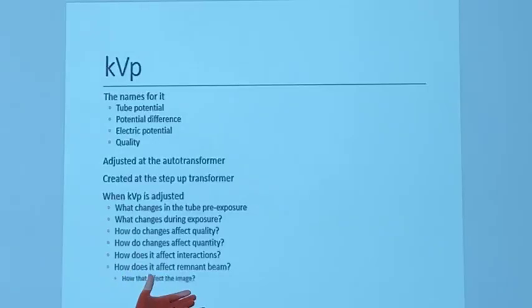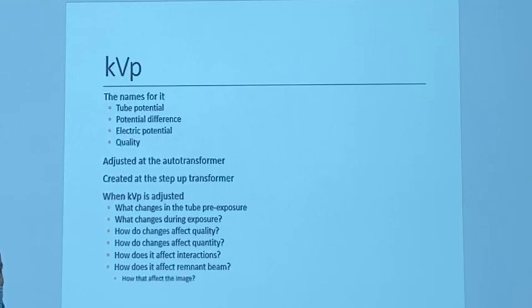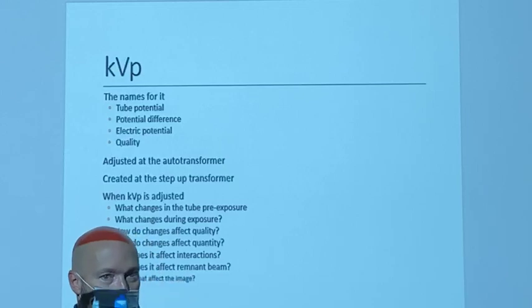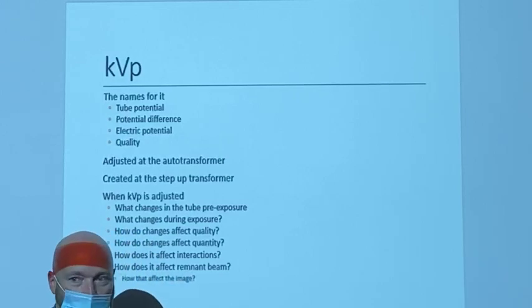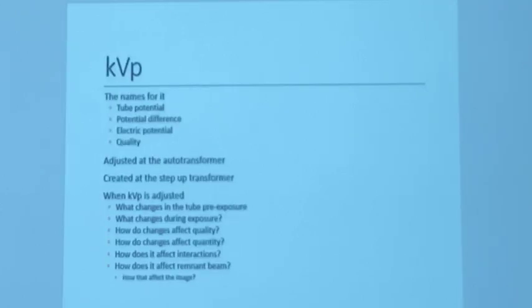But if you increase your KVP, then according to the theory in the textbook, what you should see is an increase in density and a decrease in contrast. And if you change your KVP by 15%, you take a look at both images, you're almost not going to see any changes at all. Okay, so you're going to have a hard time with that. We're going to talk about it in both contexts, but visually and clinically, it's gonna be difficult, okay?